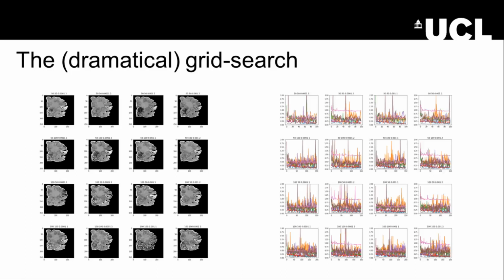So I used this approach, and then I wanted to fine-tune it, and I tried a grid search to adjust the number of epochs, the weighting factors and other things. I'm showing them very small because the observation is that grid search like this in CycleGANs is very hard, because you are not able to understand what is happening.